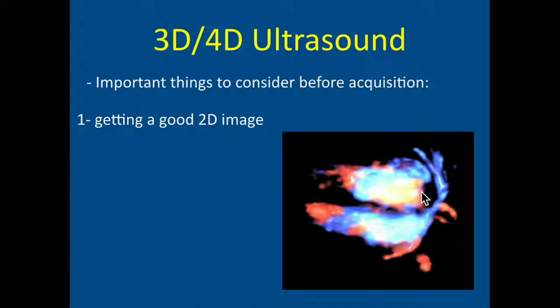I've been surprised on occasion where I have a really lousy 2D face image on maybe a really high BMI patient, and for reasons I can only amount to a stroke of luck, I'm somehow able to pull a beautiful 3D face out of that. But generally speaking, pay attention to everything that Tracy has just told you for 2D image optimization.